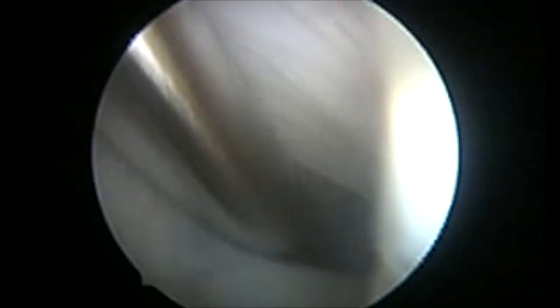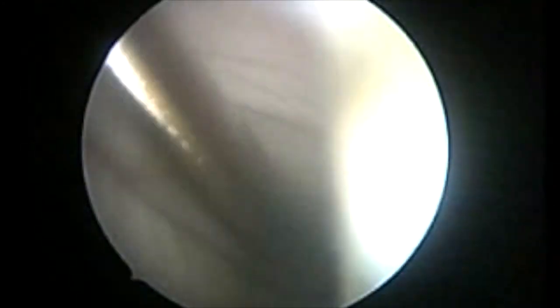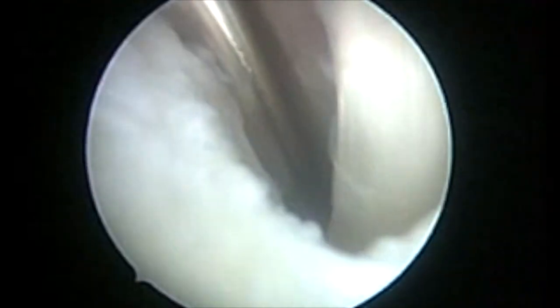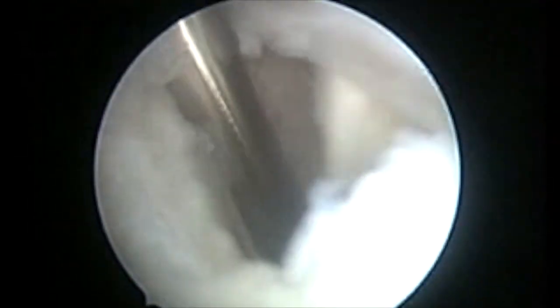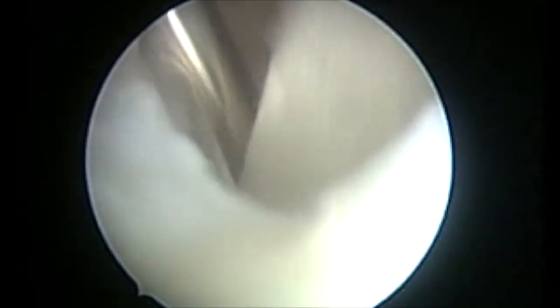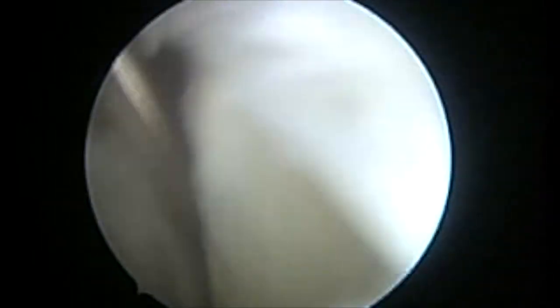The motorized shaver is inserted into the popliteal cyst and the cyst wall is gradually and gently abraded, taking care not to use vigorous suction because that can cause inadvertent damage to the neurovascular structures in the posterior compartment.